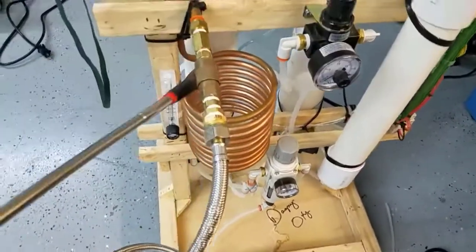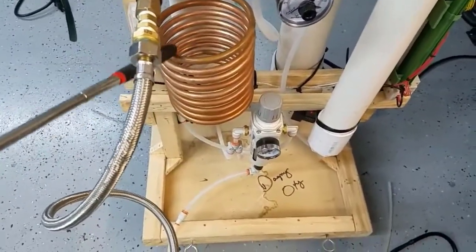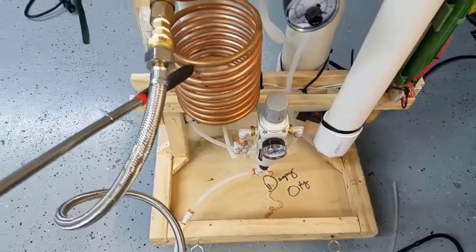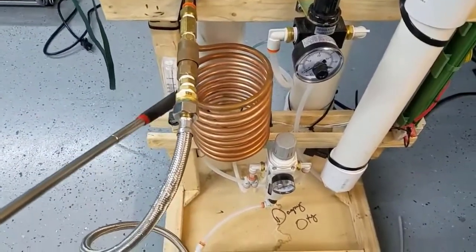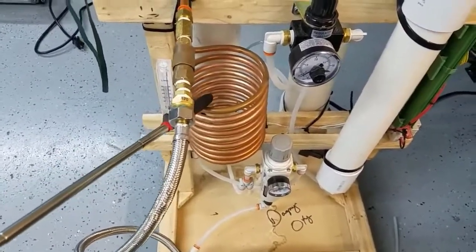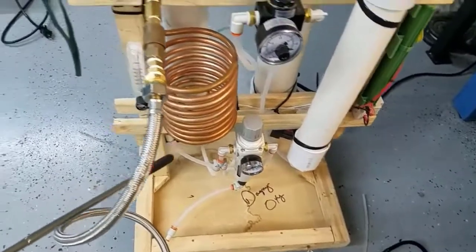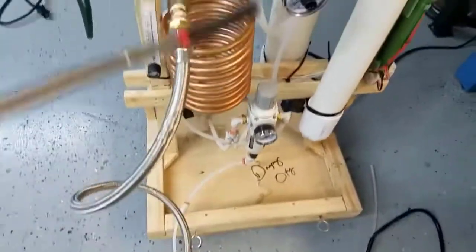The air comes out of the compressor and it goes into the cooling coils. This is a very simple, effective way of cooling the air — I believe it's about 25 feet of copper coil. You can actually feel the difference of the hot air on the top and as it cools at the bottom. So the air comes directly from the compressor into the cooling coils.